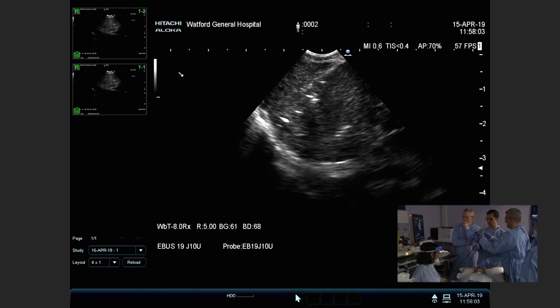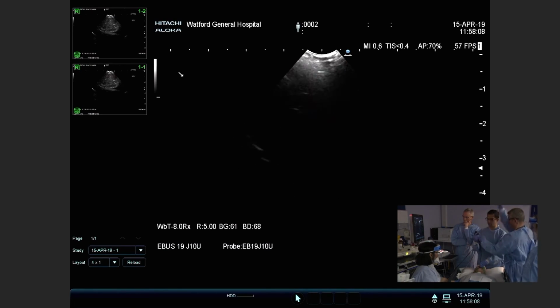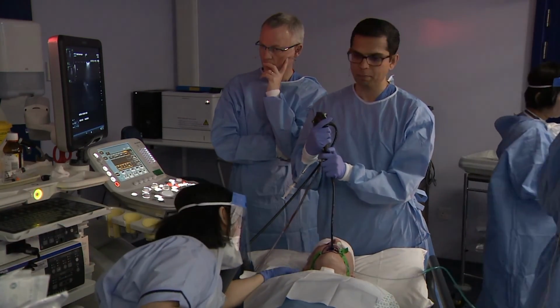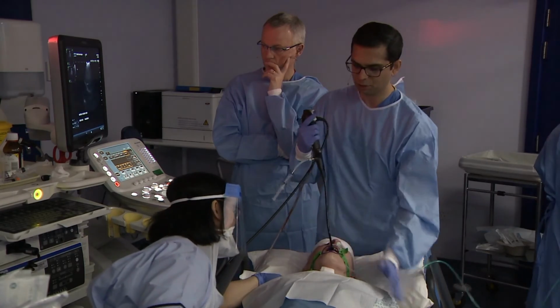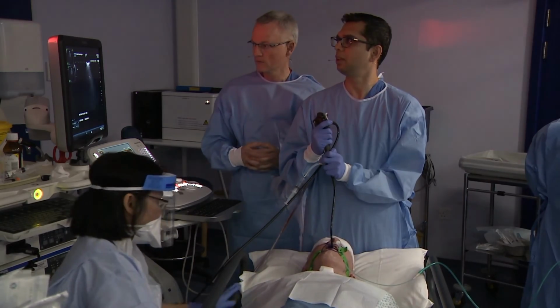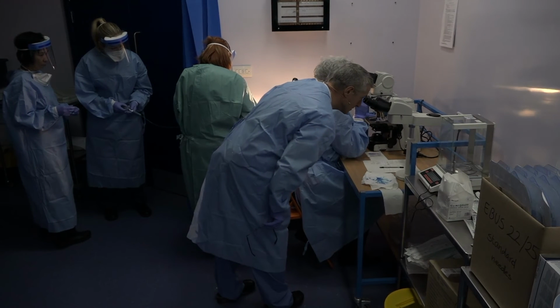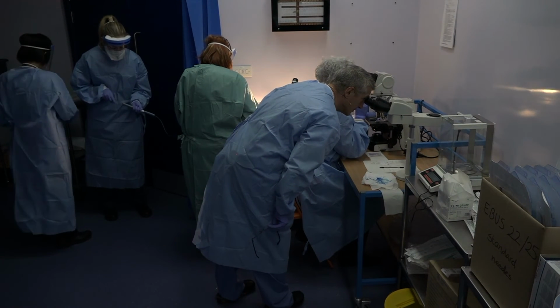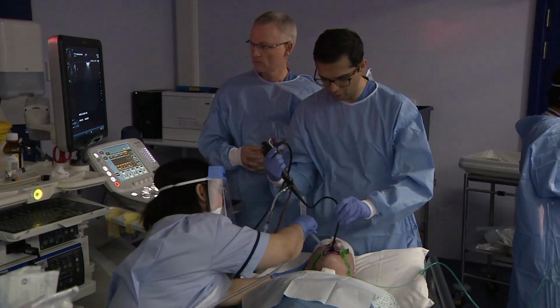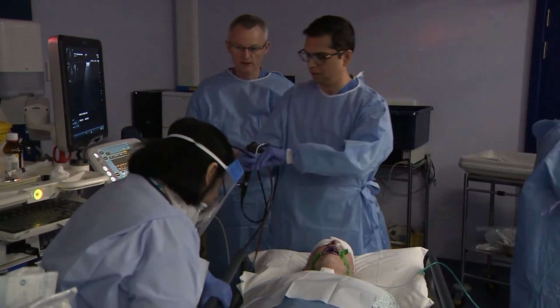Okay, we're finishing, I think. I'll just wait for this one, it's going to be for separate confirmation that we got a decent sample, and then we will come out. Nearly done, sir. Just give me 20 seconds to confirm we got a good sample, and then I will come out. Try not to talk, otherwise the back of your throat will get much more sore. Quite cellular. Nearly done. All viable, no necrosis here, and actually has a kind of papilliform look to it. Decent material, team. Okay, all right, that's it. I'm coming out. Very well done. Yep. Very, very nice demonstration.